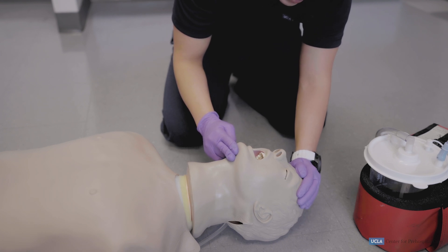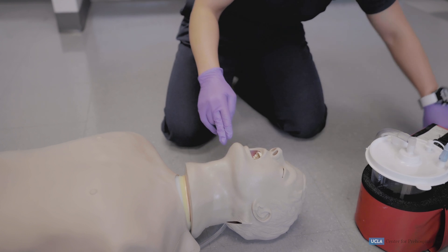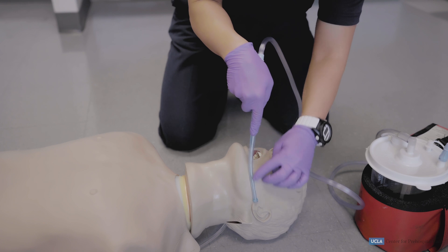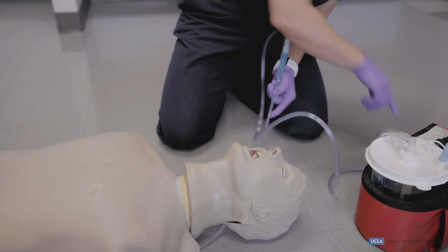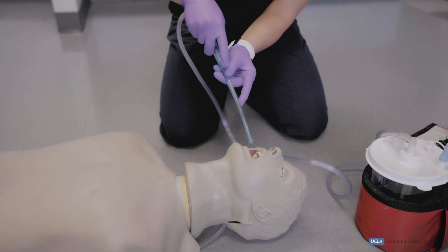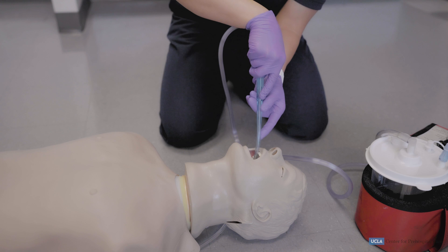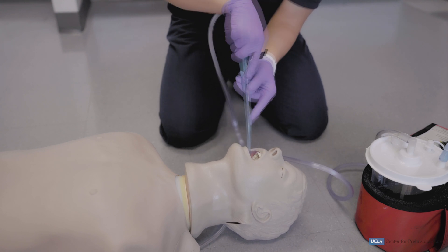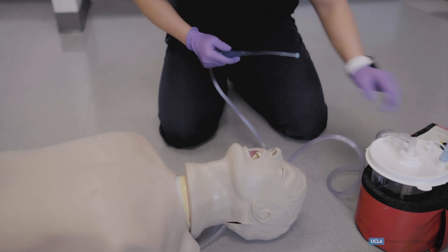I'm looking inside the mouth and see vomit and secretions. Manually suction the patient by measuring and inserting as far as you can see, from the corner of the jaw to the corner of the mouth. Suctioning can be for no longer than 15 seconds in an outward circular motion. Mouth and oropharynx are clear.